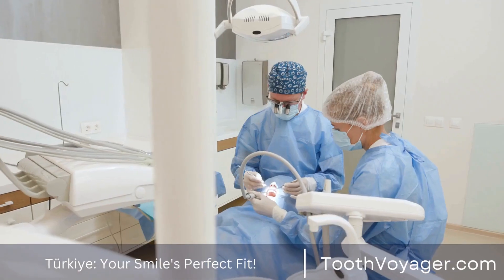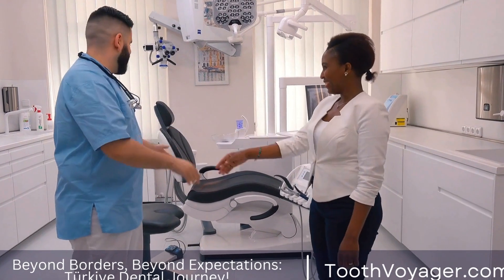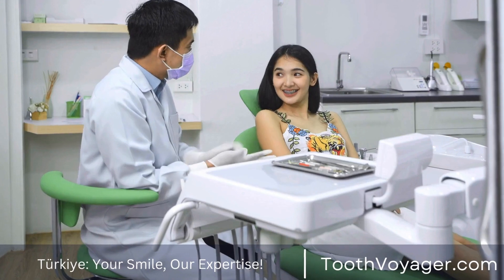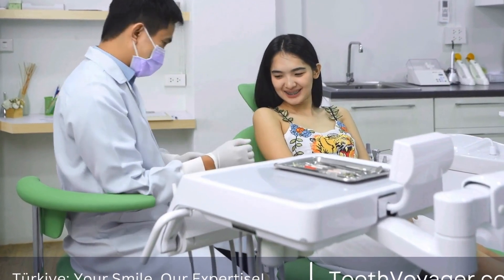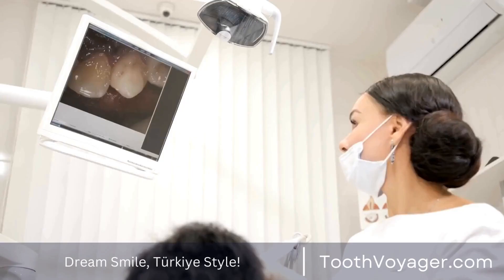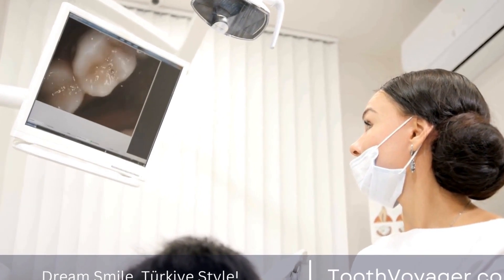4. Crafting the crown. Once the tooth preparation and material selection are complete, the crown is crafted in a dental laboratory. Skilled technicians use the impression of the tooth to create a custom-fitted crown that matches the shape, size, and color of the natural tooth. The crown is then polished and refined to ensure a perfect fit and natural appearance.